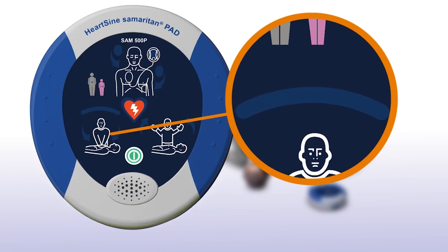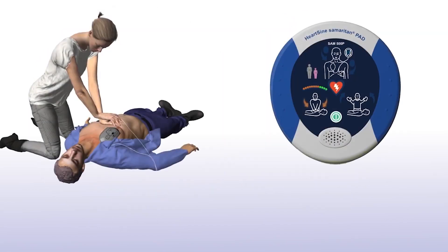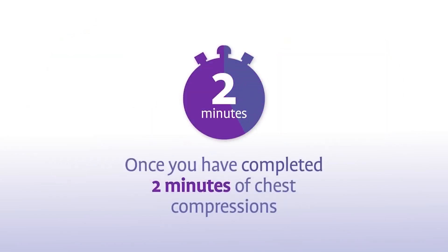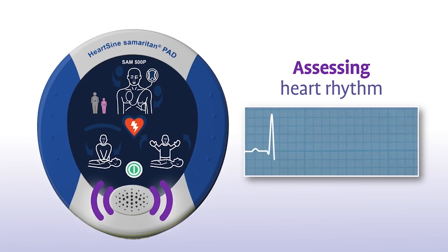It will also provide feedback when the chest compressions are correct. The combination of chest compressions and defibrillation is the best treatment you can provide until medical professionals arrive on the scene. Once you have completed 2 minutes of chest compressions, the SAM 500P will prompt you to stop chest compressions and again assess the patient's heart rhythm. Assessing heart rhythm — do not touch the patient.